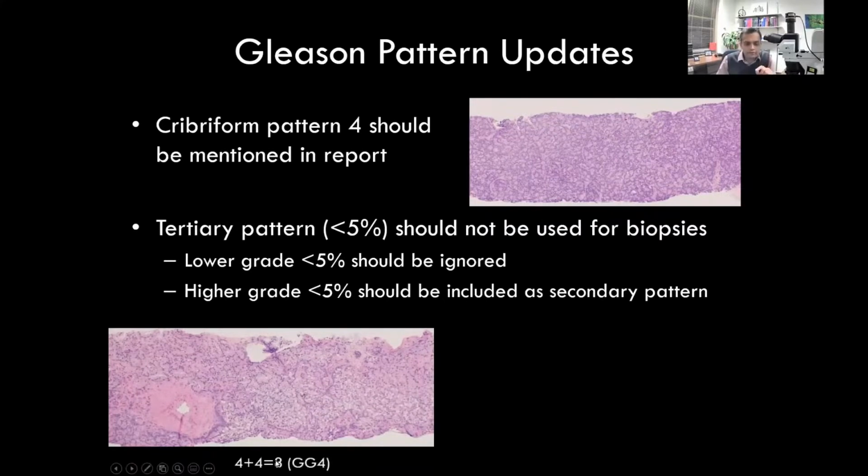So this case, I would call as 4+4 equal to 8 and ignore this less than 5% pattern 3.